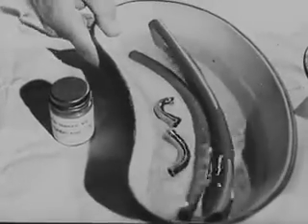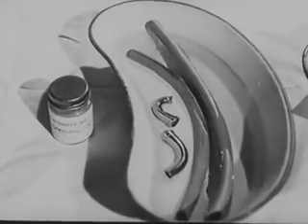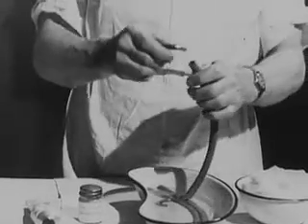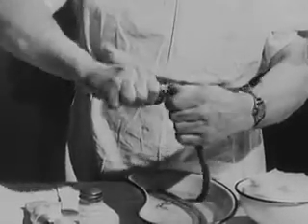Immediately before use, the tubes are immersed in a solution of biniodide of mercury in the proportion of 1 to 1,000. See that the metal connection is properly attached before lubricating the tube. It might be disastrous if it came apart during anesthesia.